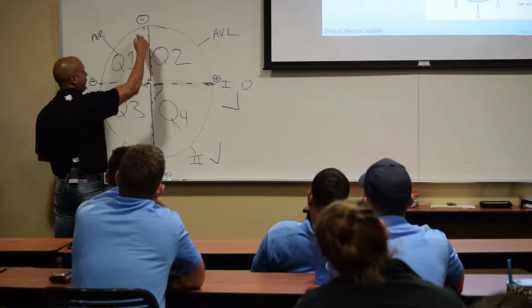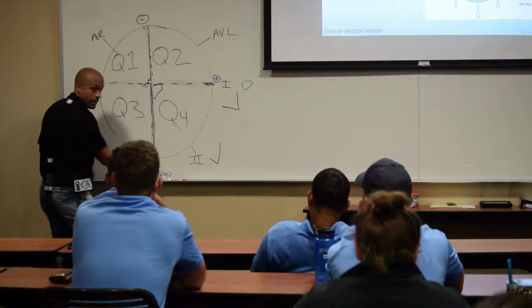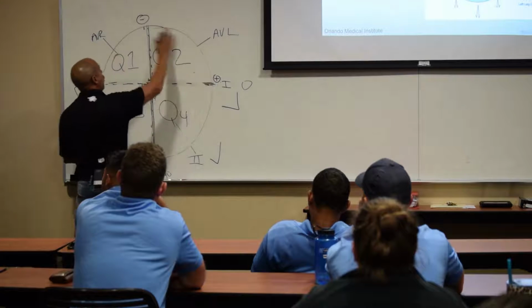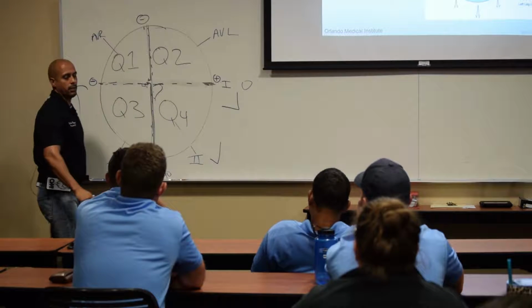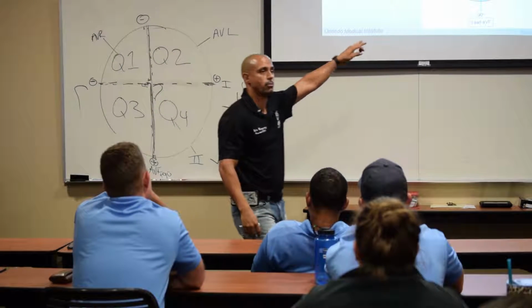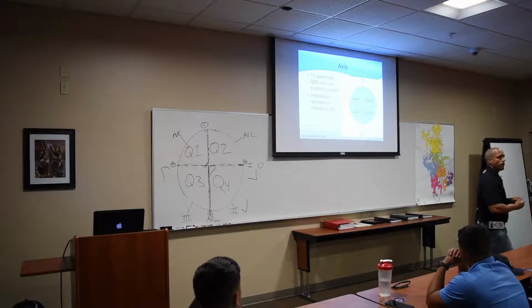So everything above here, all right, so let's go. So this is AVF. Everything down here is positive. Everything up here is what? So if I did the imaginary line, all this is what? All this is positive. Very good. Very good. You're picking up what I'm putting down. 4 quadrants. We broke that down, right? I like to rough rule things. Rough rule is good. Okay?